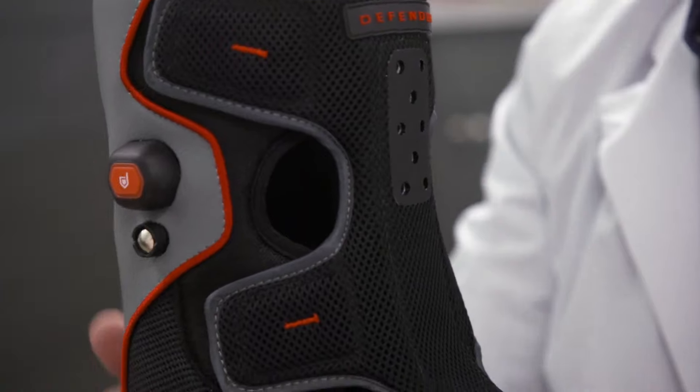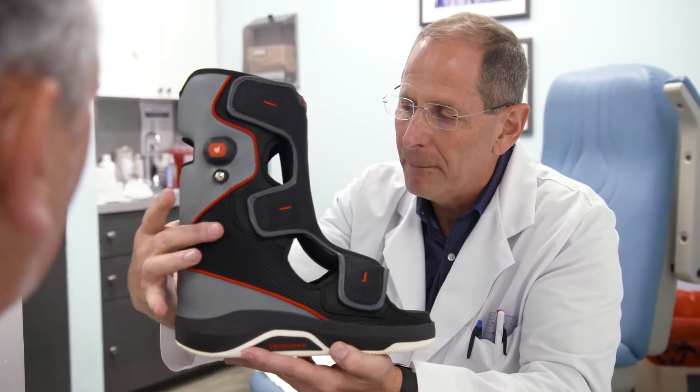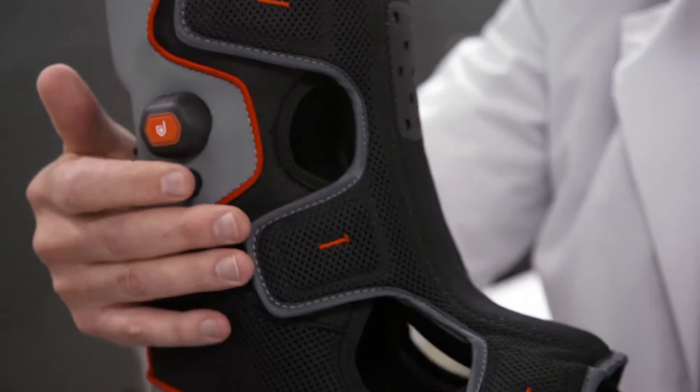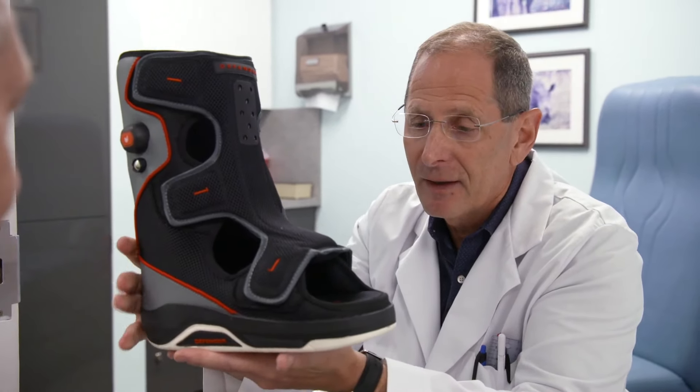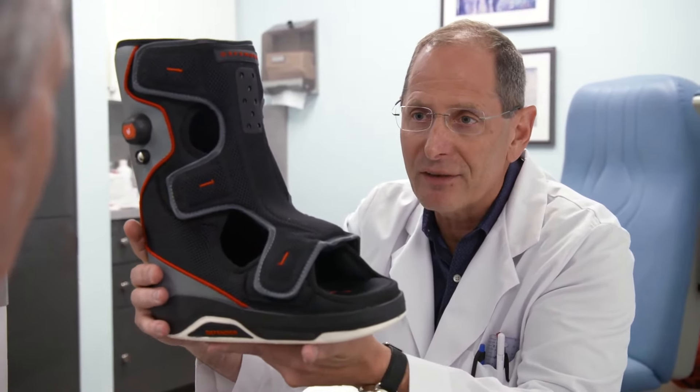And what's this here? So this is a pneumatic pump system that has an airbag which inflates the entire back of the ankle and foot area, which helps with fitment and proprioception. Wow, sounds like a lot of science working there. Approximately 13 granted patents and 8 pending in one walking device.